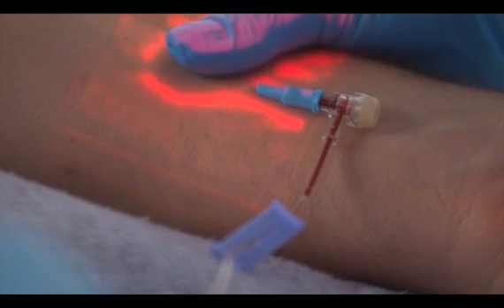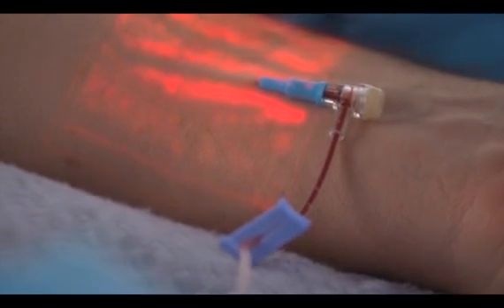You will be able to see if you miss the vein or if you are beside it. At this point, you can pull back and readjust or reposition the angle of the catheter.